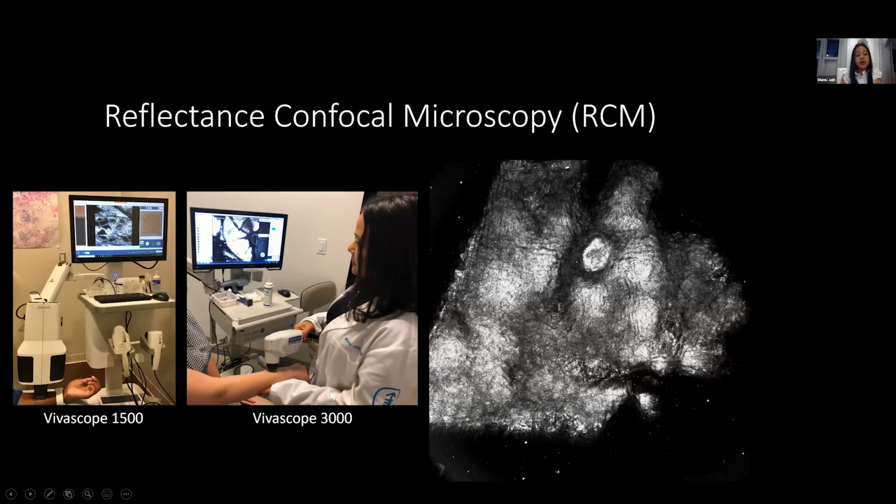This is another device, which is also reflectance confocal microscopy. We call this a handheld device. See how small it is? So you can actually image lesions located on the nose and earlobes, where you cannot put the bulky device. So bottom line, these two devices are commercialized and we have them at MSK. We have been using them for years now.